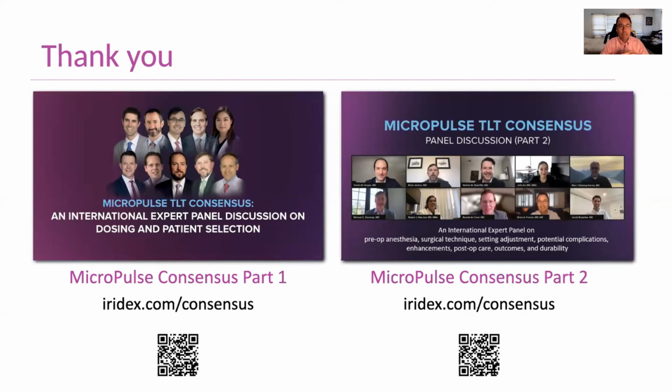The second one is, if you are on the fence about what patients to start off with, some of my happiest patients are, as has been discussed previously, patients who have a tube that's functional, but the pressure is not that good. This is a great option. It's non-incisional. You're not putting in a second tube and running all those risks of exposure and strabismus, et cetera. So that's a really nice patient population to start with to get good results.